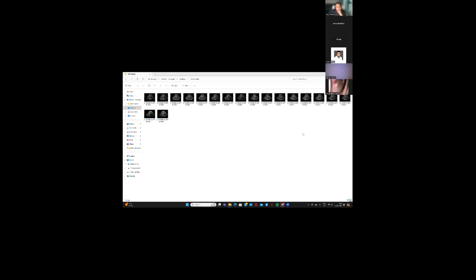I'll start with the presentation. My PowerPoint on my desktop was not working, so I'll just tell the history verbally and then I will start the images. This is a 2-day-old term baby, 39 weeks, delivered to a gravida 3 para 2 mother who was diabetic on metformin during the antenatal period along with chronic hypertension on labetalol.